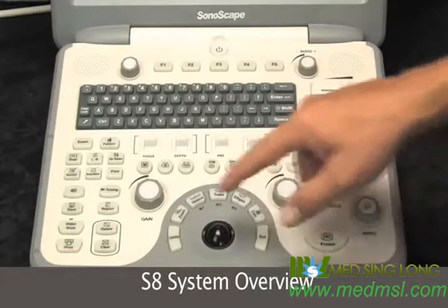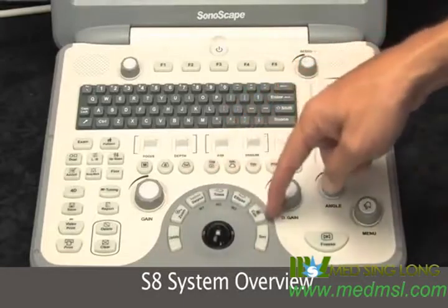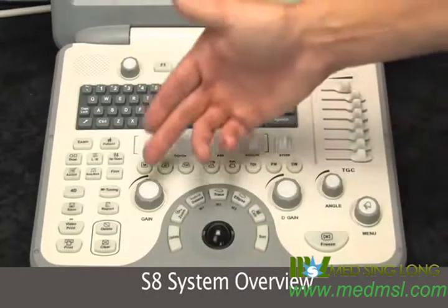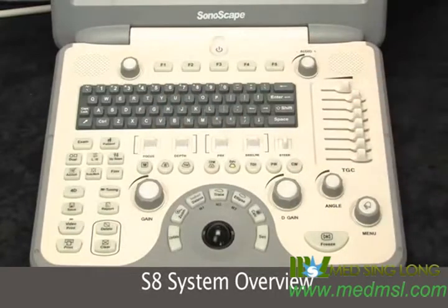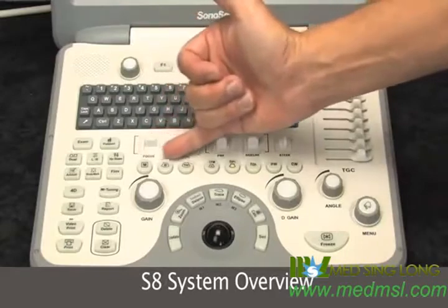You have your update, zoom, and then your calculation buttons, your measurement and calculations. B-mode gain and Doppler gain are very close to the trackball, so very centrally located, and your main mode buttons.